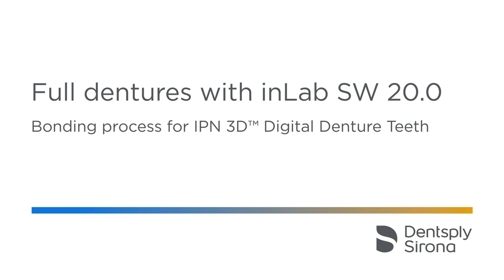Welcome to this video tutorial on full dentures with InLab20 software, bonding process for IPN3D digital denture teeth. In this video, you will learn how to bond the prefabricated IPN3D digital denture teeth onto the denture base correctly and how to polymerize it.